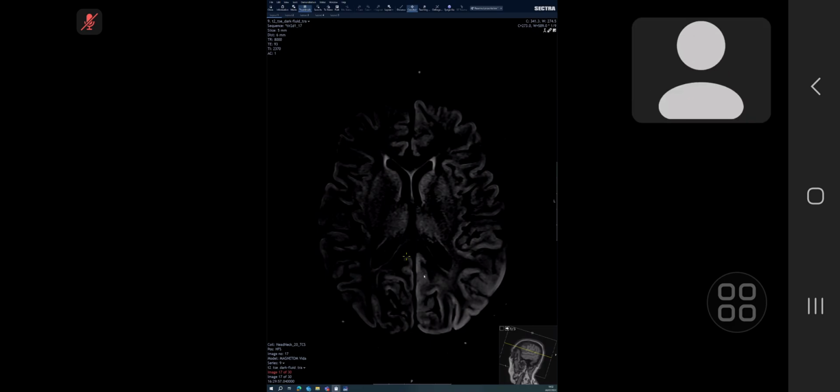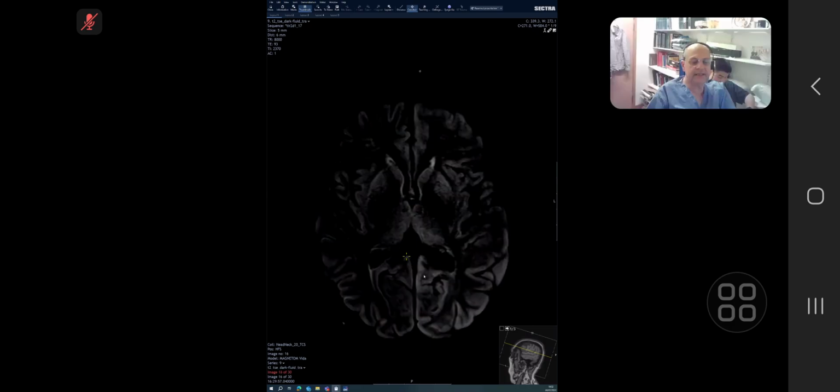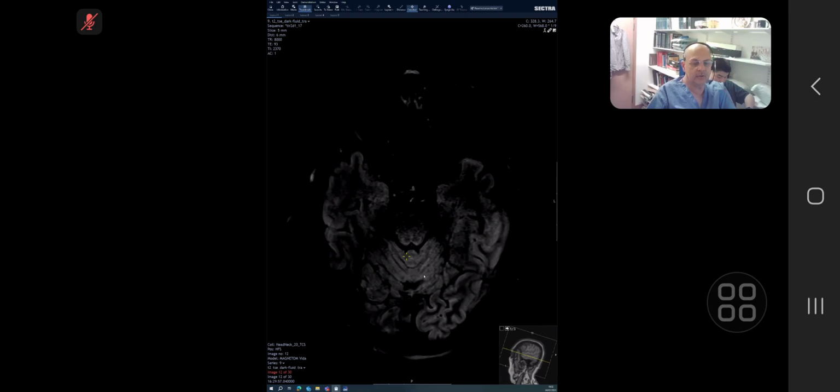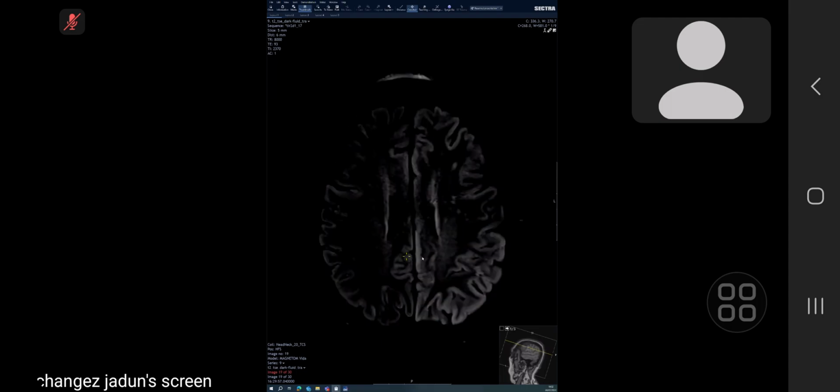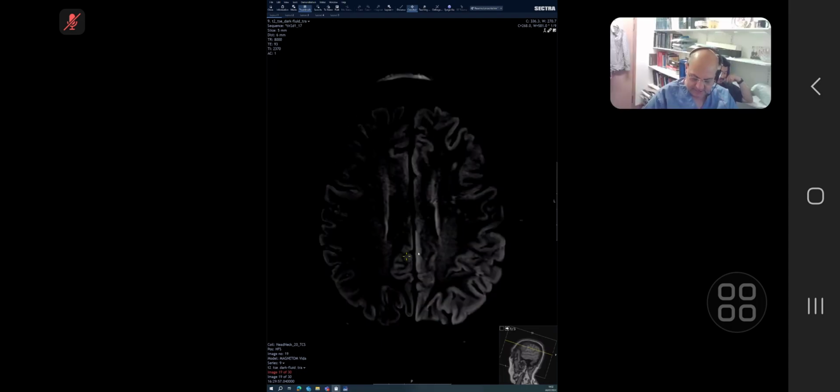Right, sir. The reason why it is very important to diagnose this, the clinical significance of this, is that if this patient is going for any operation, they have to quarantine all the equipment. So it is a vital and crucial diagnosis. Luckily, it has got quite a diagnostic history and quite diagnostic appearances. Excellent. Let's see another case.